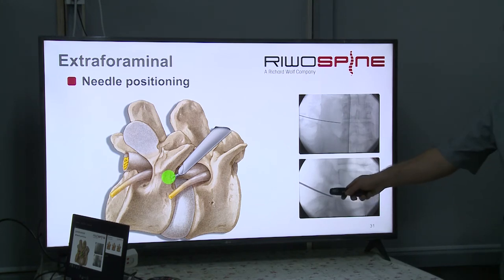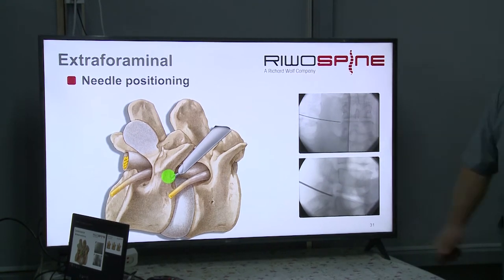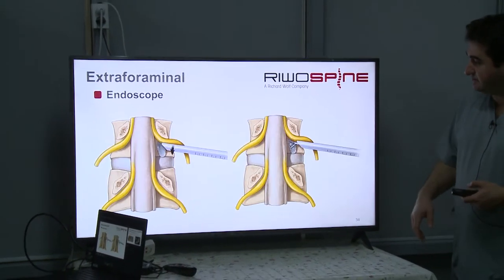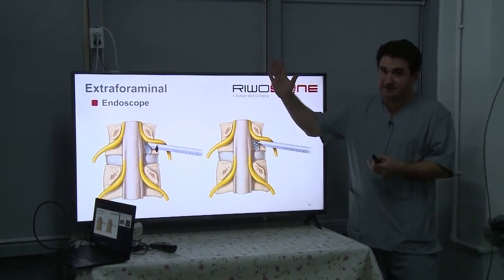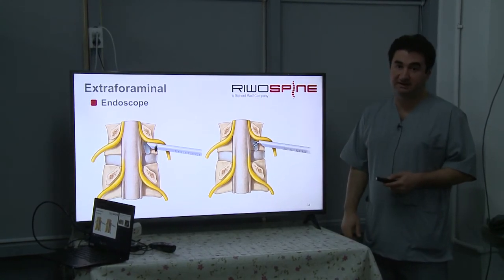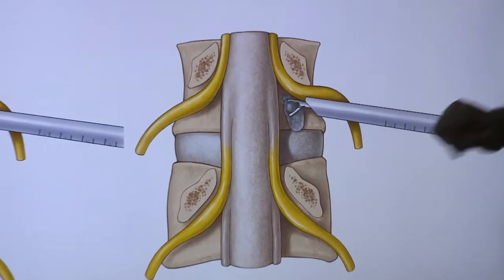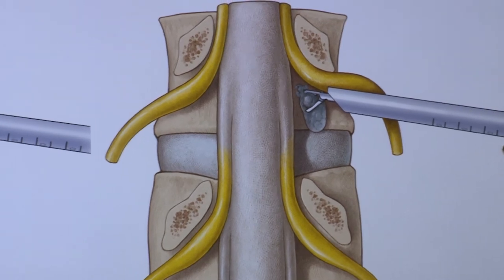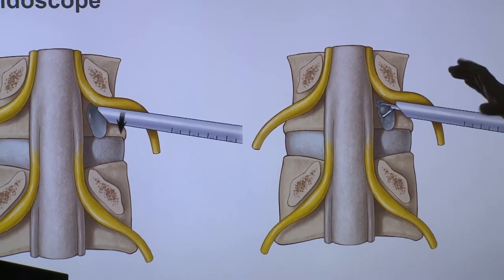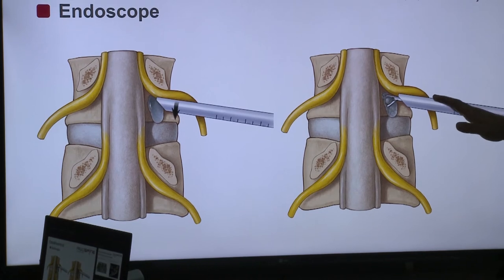Pedicle and the facet junction. Okay. It's clear. Yeah, we place it here. And then again, the mandrin and dilator and everything. We start the operation and we dissect the anatomy under our visual control. Then we find the extraforaminal herniation here. Of course, treating extraforaminal pathologies with the endoscope is a really good solution for the patient. But the challenging part is that it's the most difficult endoscopic operation for the surgeons.